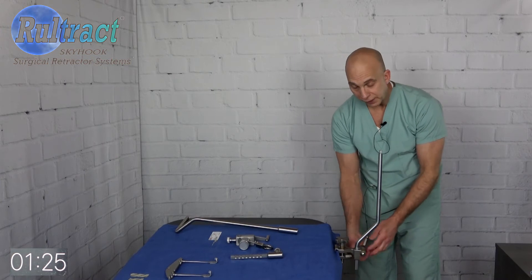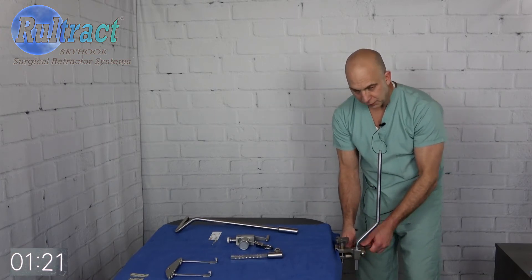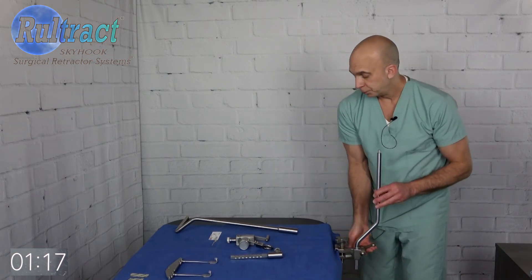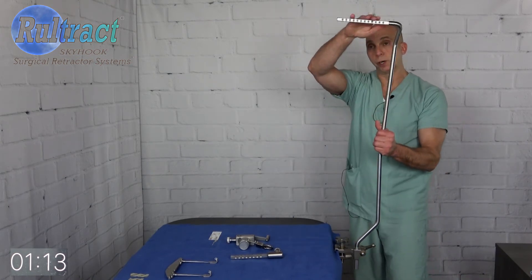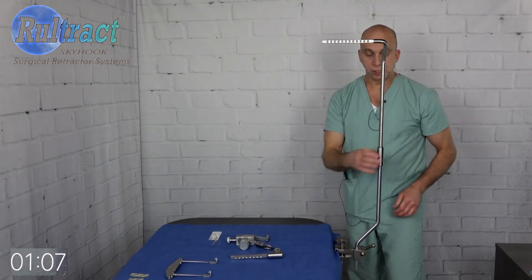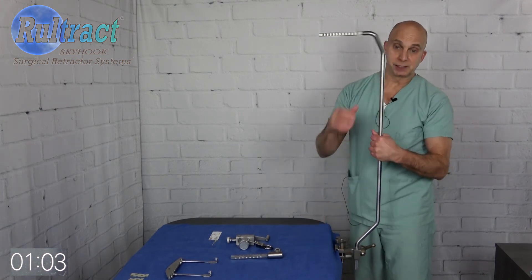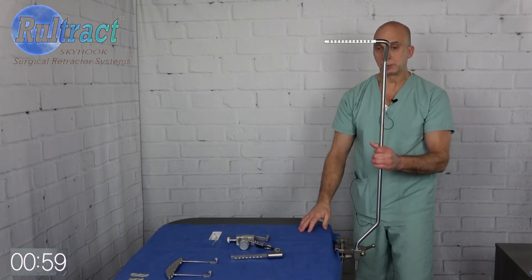There's a wing handle here — go ahead and just tighten that wing handle a little bit. It doesn't have to be real tight, just tight enough to provide stability for the bottom post. Now you're going to put your top post on, and obviously you want this part of the top post going out over the patient. Go ahead and set that on to the bottom post, turn it a little bit, and make sure it's properly seated. If it's not, it will spin.